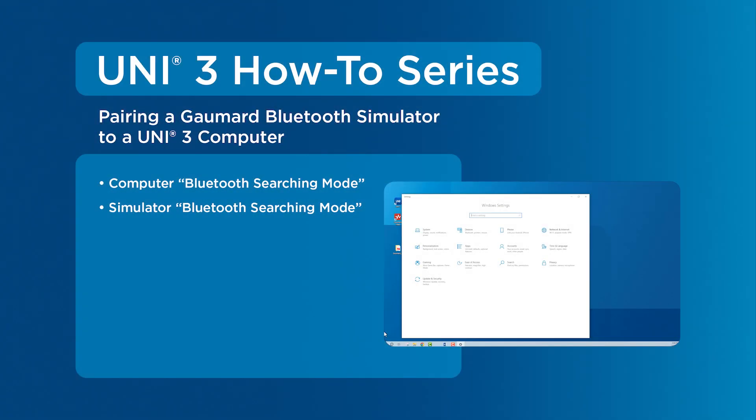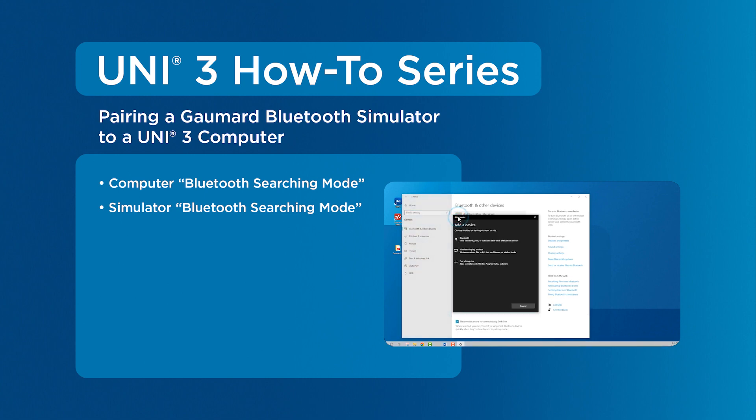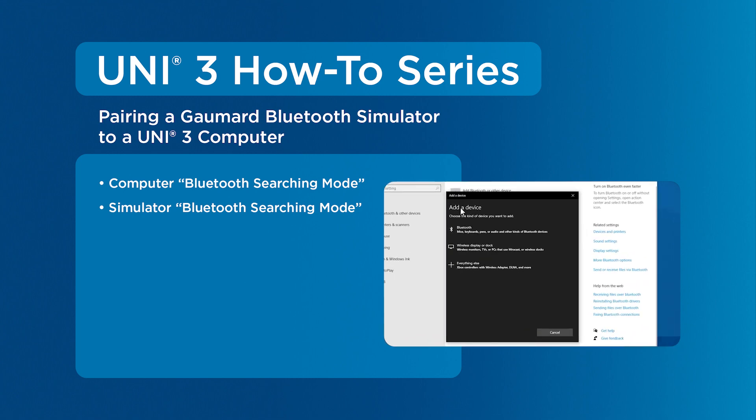This tutorial will cover the one-time process of pairing a Gaumard Bluetooth-capable simulator to a Uni3 computer. If your Bluetooth-capable simulator is already paired, see our video on connecting to your Gaumard simulator.